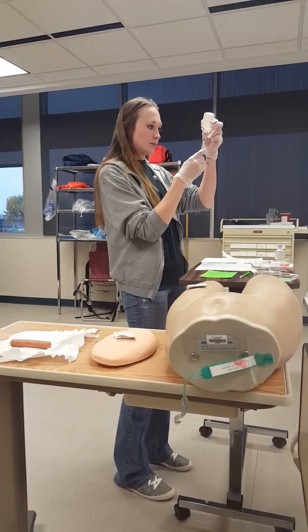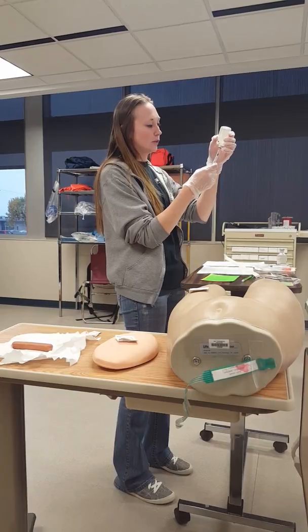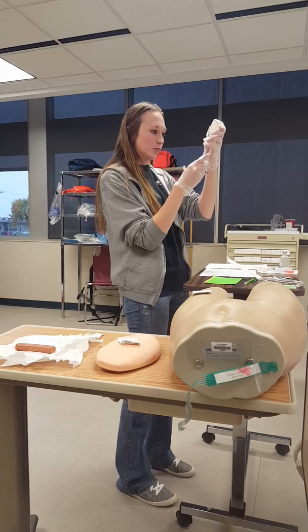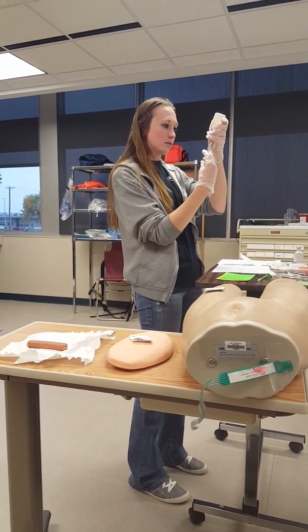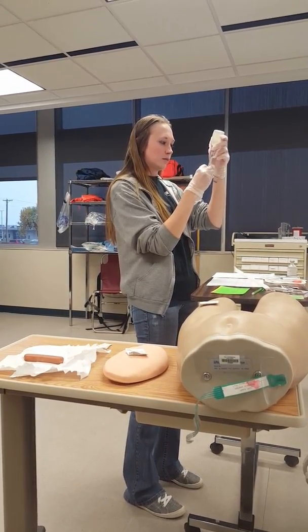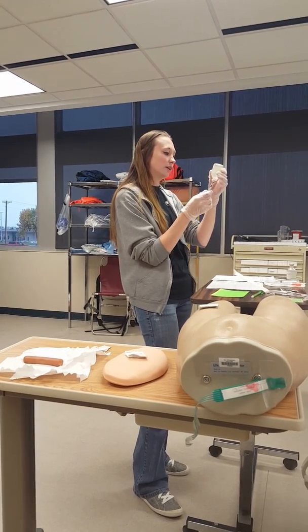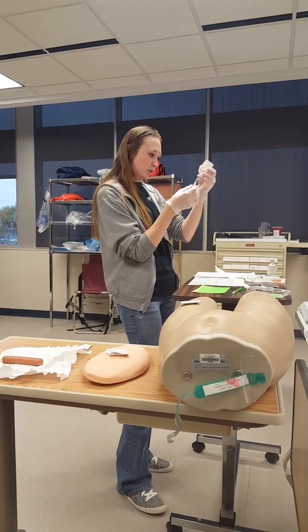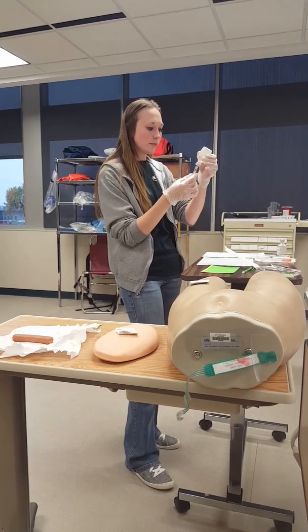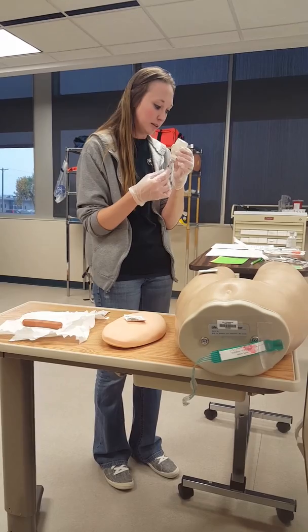and I'm going to draw the 0.1, and I'm going to do my first check, and I make sure it's tuberculin 0.1 mLs, and it's 0.1 mLs. Get the air bubbles out of there. And then I would do my second check, tuberculin 0.1 mLs, and check it on my MAR, tuberculin 0.1 mL. And then I'm going to explain what the tuberculin is.